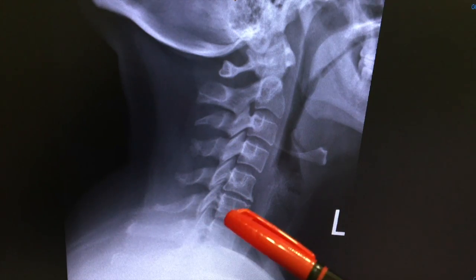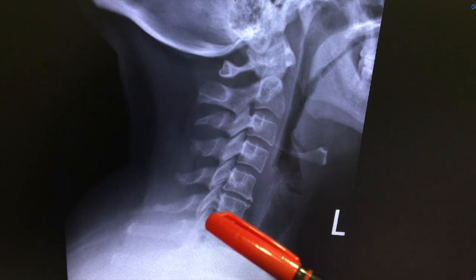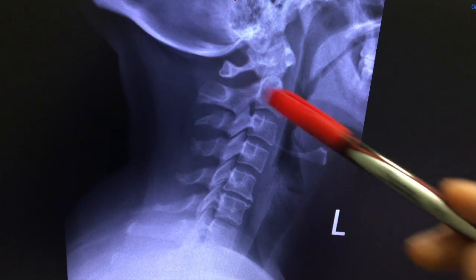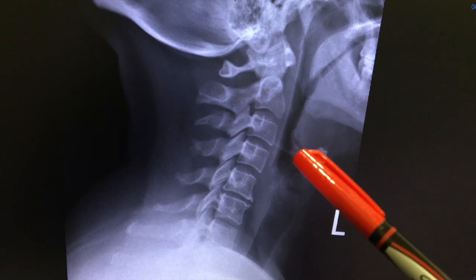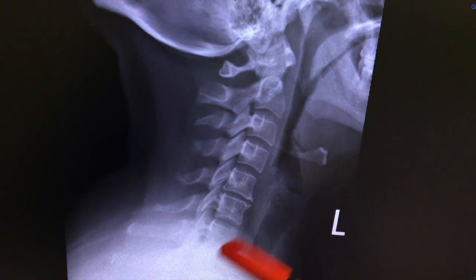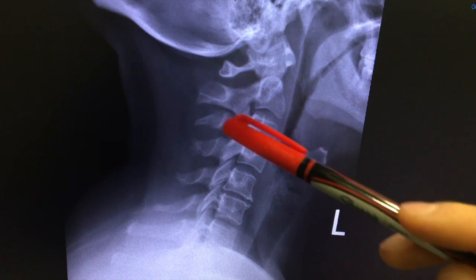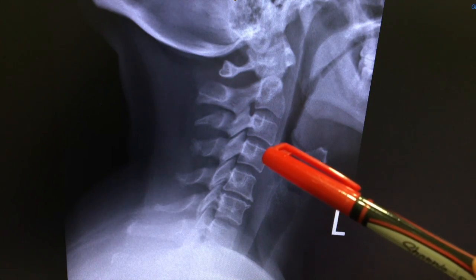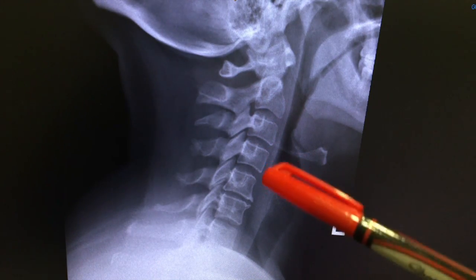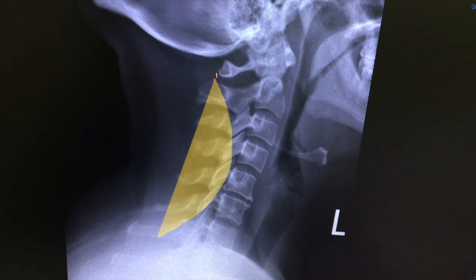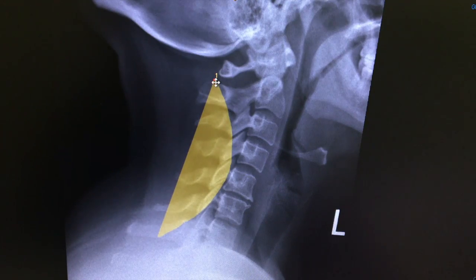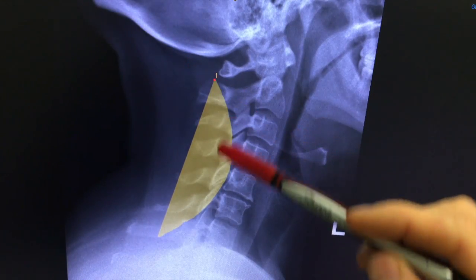Three important things we need to note. When we're looking at the neck from the side — this is the skull, this is the jaw, these are the teeth out front — you're looking for three things: a nice C-shaped curve, kind of like a banana; nice square bones; and a nice space between the bones. The bones in the neck should have a nice curve, as your neck should have a lordosis, which is that banana shape.